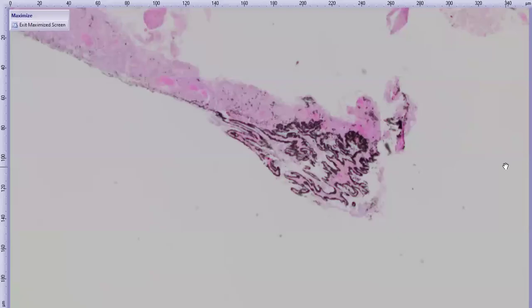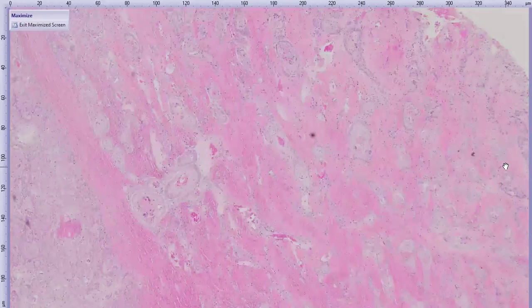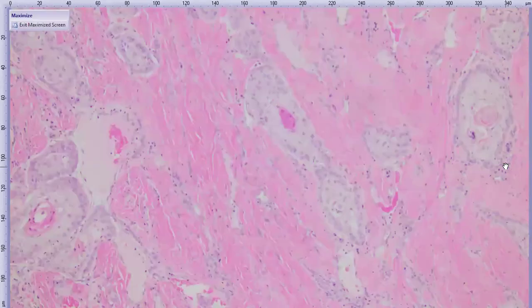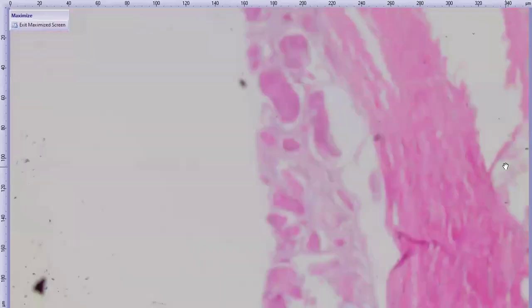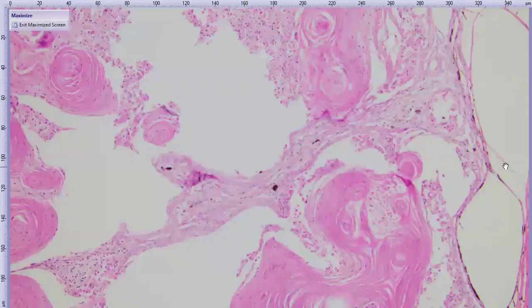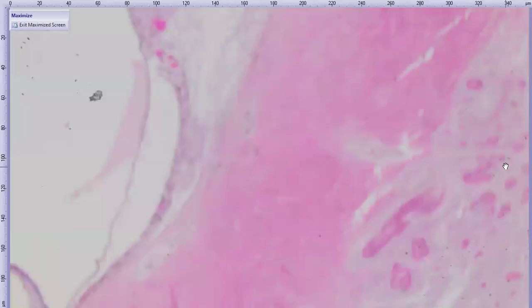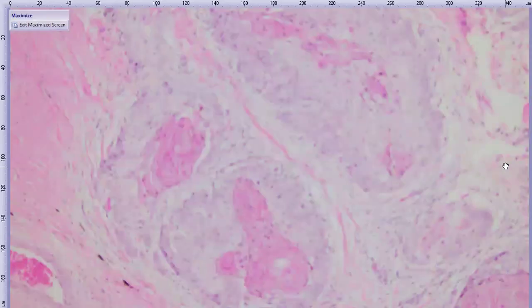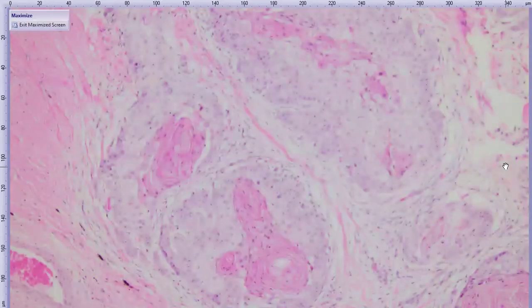And just again, showing off the extent, we lose the uvea a little bit, unfortunately, artifactually in this section, but here it is in the sclera, just to show you its invasiveness. Here it is back in the choroid. Barely any uveal tissue left here. It's pretty much all this tumor. And here it is extending as far back as the orbital tissue, kind of next to the optic nerve. Same tumor. So this is a really invasive neoplasm.